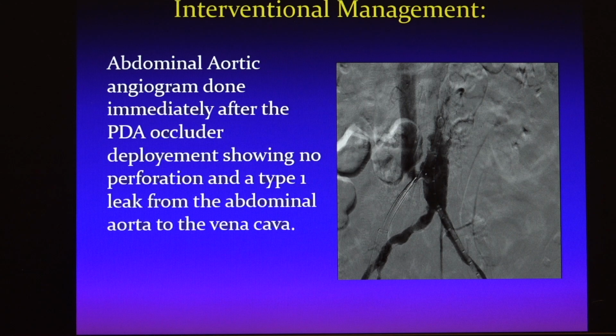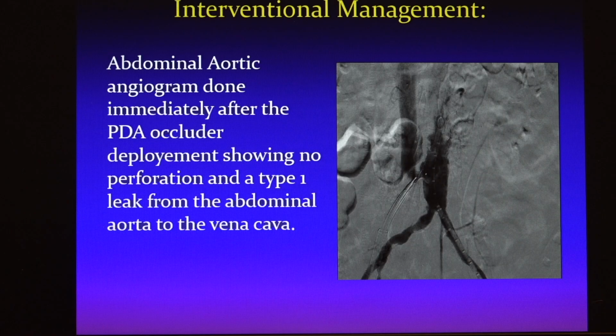So what you do after you track the sheath here, you can notice that the major big sheath is here. Then you retract the Aegis sheath and deploy the first disc, as you can see here, and then you push the other disc as well. And at this point, we did that. And what you want to do at this point, you wait for 10 minutes, as long as you know there's no massive bleeding.